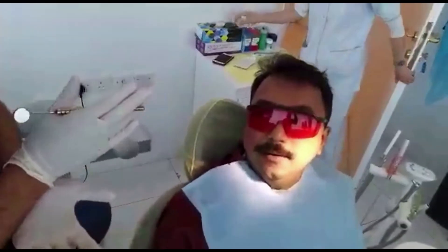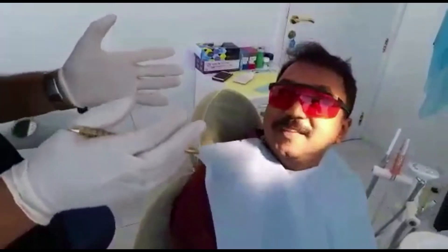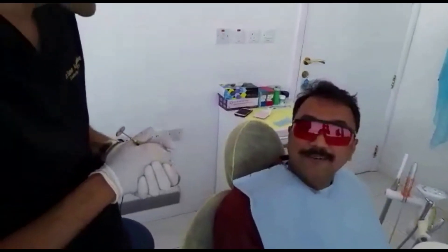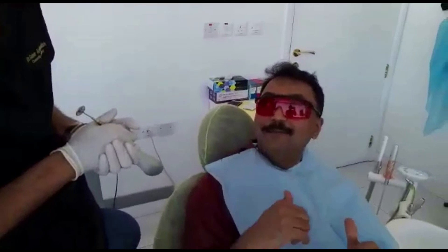All right. Your pain experience? Yeah, it was a very good bit. Did you imagine that I could drill your bone without pain? Yeah, yeah. The Quick Sleeper experience was very good. Actually I wanted to try it on my team before — yes, I did it, right?